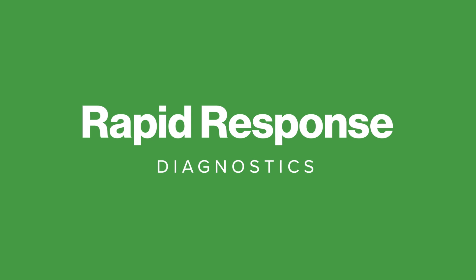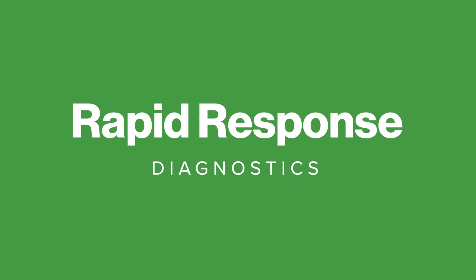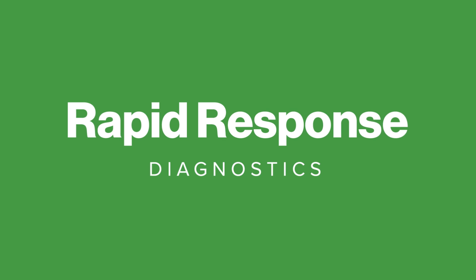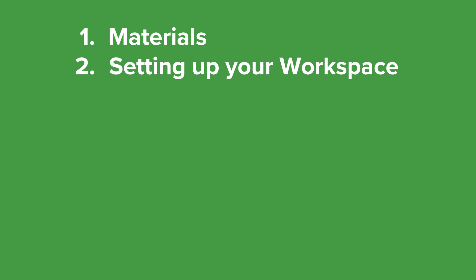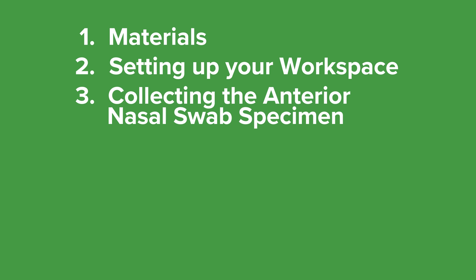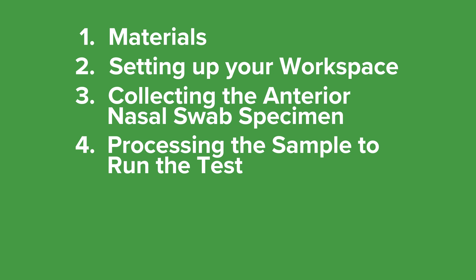This is a demonstration of how to use the rapid response COVID-19 antigen rapid test device. This video will explain the following: the materials you will need to conduct the test, setting up your workspace, the steps to collect a nasal specimen using a nasal swab, and the steps to process the sample and run the test.